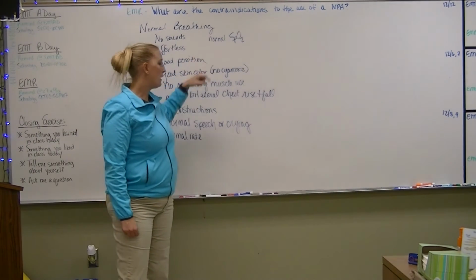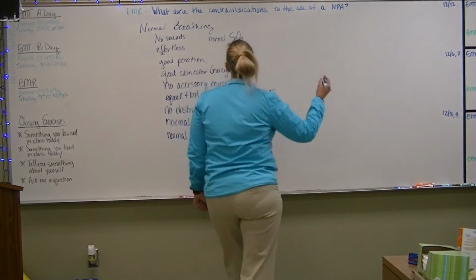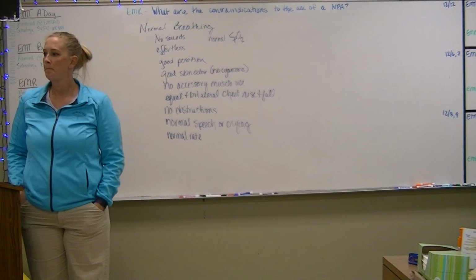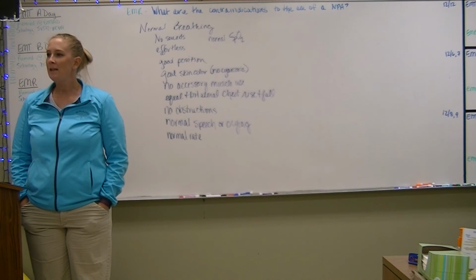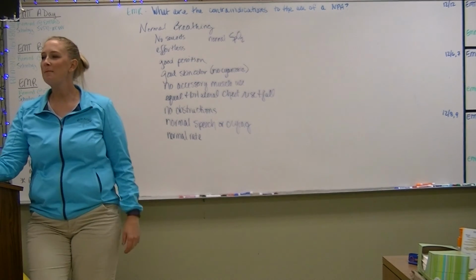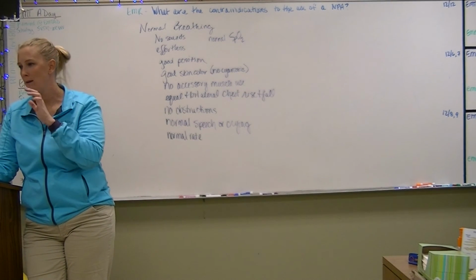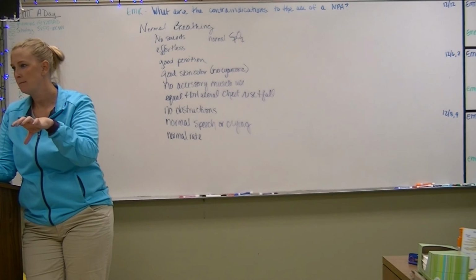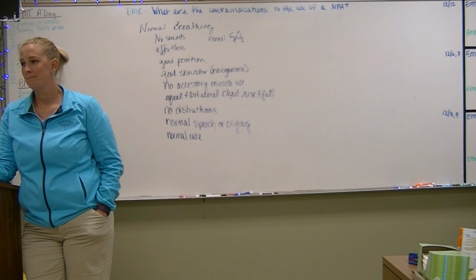All right. So how about the signs of abnormal breathing? How do you get a normal SpO2 though if they're... Because it just measures what the hemoglobin has. It doesn't measure whether it's oxygen or carbon monoxide. The machine measures how much of whatever is attached to the hemoglobin. It doesn't care what it is that's attached. It just says 99% of your hemoglobin has something attached to it. Well, that is a game changer. I just assumed it was reading what you wanted, not everything.